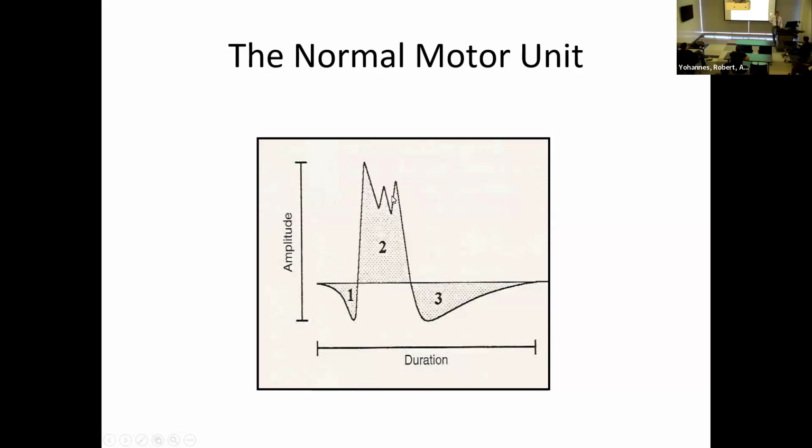So those on top are abnormal, but not abnormal enough for us to call it that there's more than the three basic phases over here. So when you count phases, remember that it has to cross the baseline. So in this case, we have 1, 2, and 3 phases.